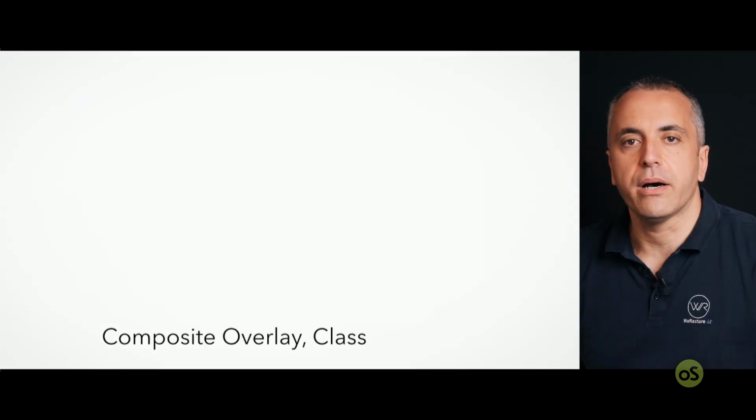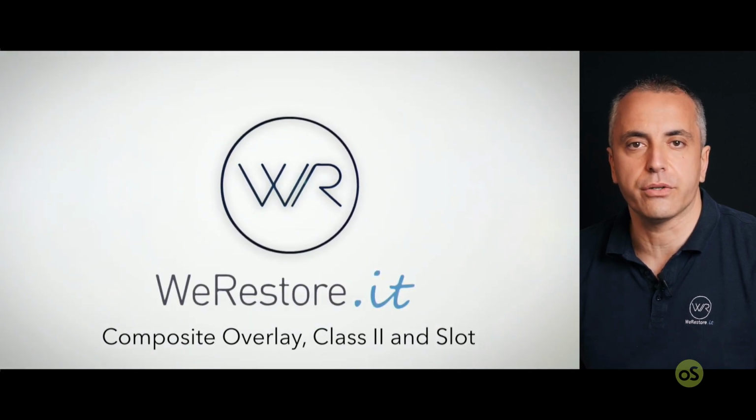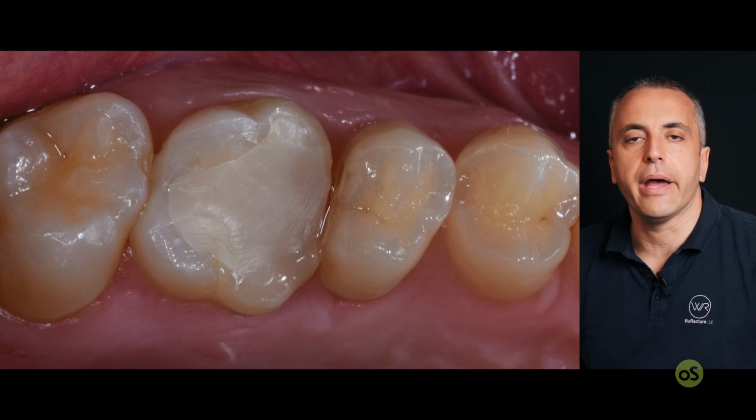Hi, let's talk about composite, direct and indirect. In this case, we will talk about an overlay made in composite and two direct restorations. One will be a class 2 and one will be a slot restoration.